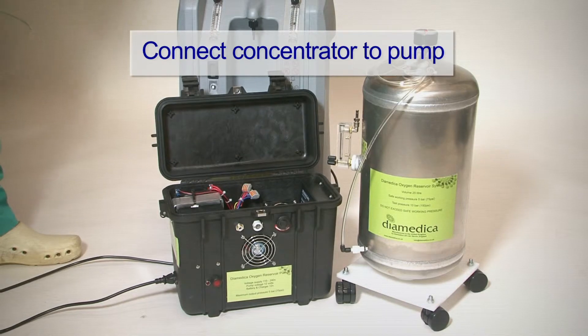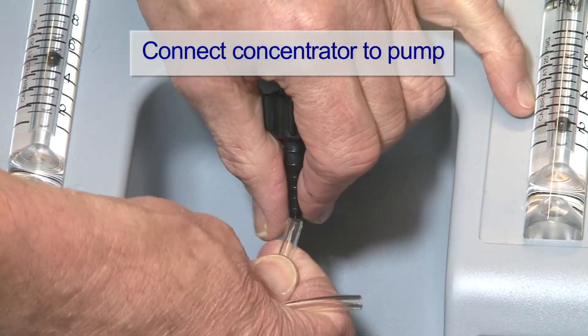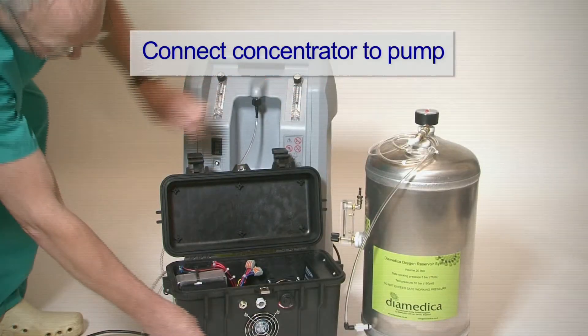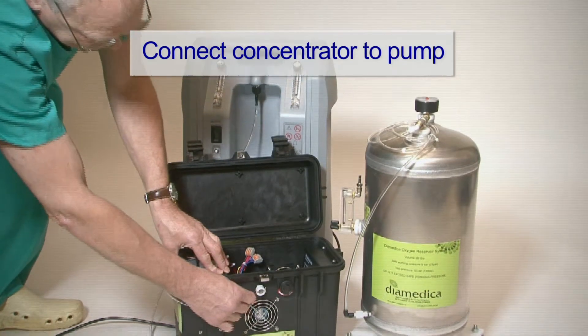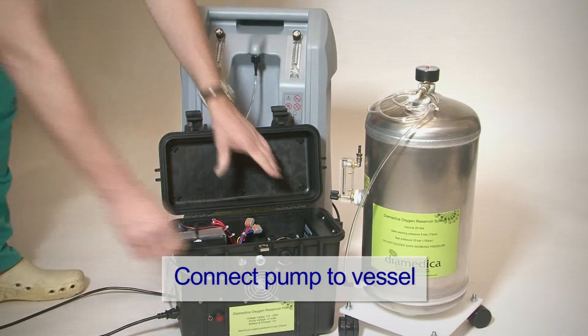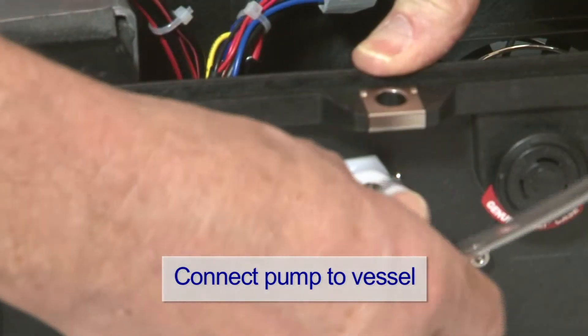Connect the concentrator outlet to the pump inlet with the tubing supplied. Connect the reservoir vessel to the out connection.